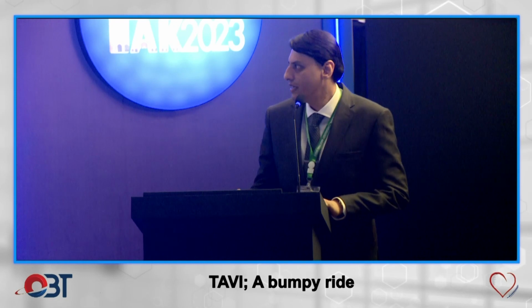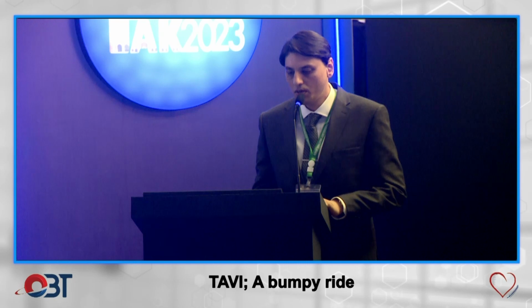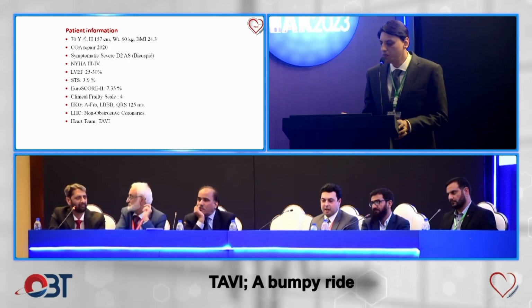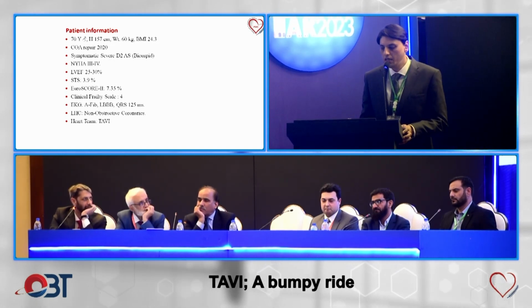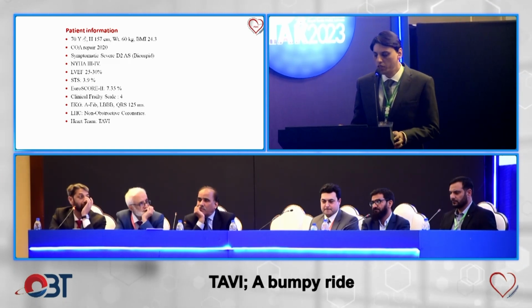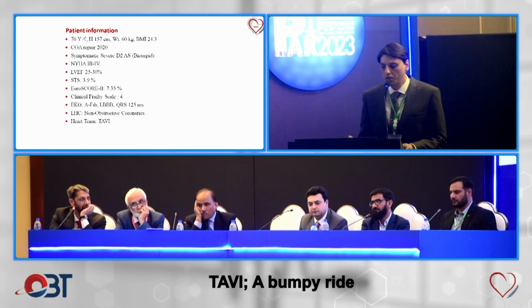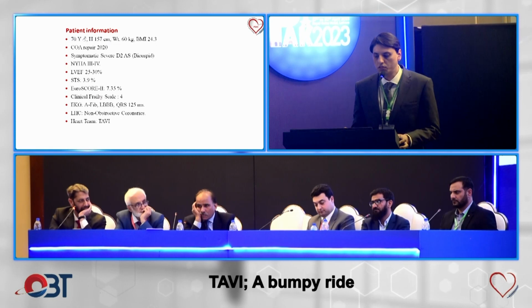And I'm back again with another interesting case, this time TAVI, a bumpy ride. So, a 70-year-old male patient with a BMI of 24. He had a history of coarctation of aorta, surgical repair in 2020, now presented with symptomatic severe stage D aortic stenosis, NYHA class 3, moderate to high surgical risk. Patient had a baseline EKG of atrial fibrillation, left bundle branch block with a QRS of 125, non-obstructive coronary arteries. Heart team decided for TAVI.